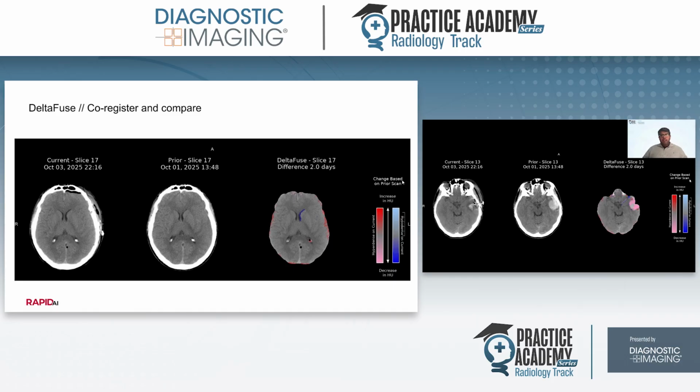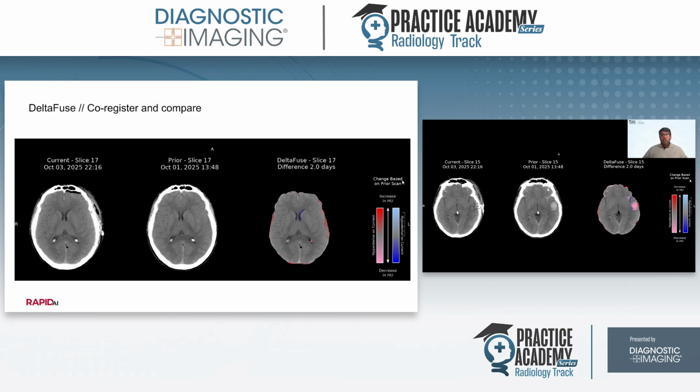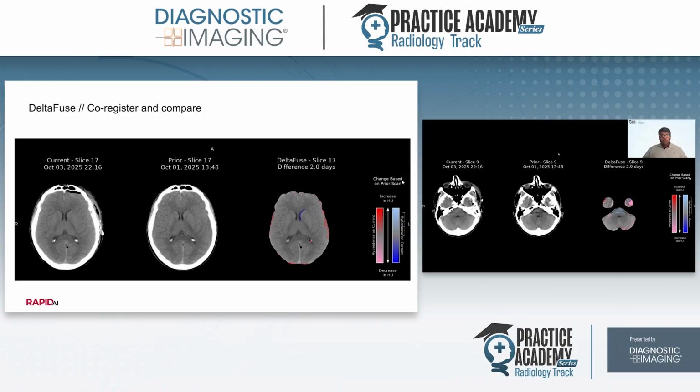Then the second thing it does, it provides a DeltaFuse image. So what this does, it is taking the prior image and subtracting the current image and tells you what the difference between those scans really is. So if you have worsening hemorrhage, you'll start to see an increased area of hyperdensity. So like in this instance where a patient underwent a hematoma evacuation, their hemorrhage reduced.